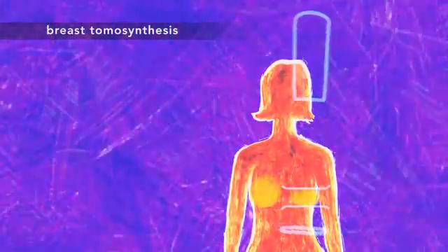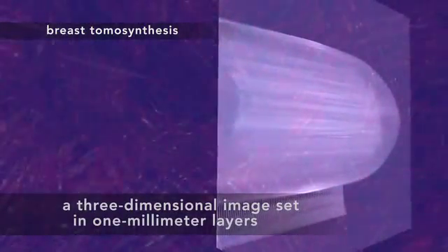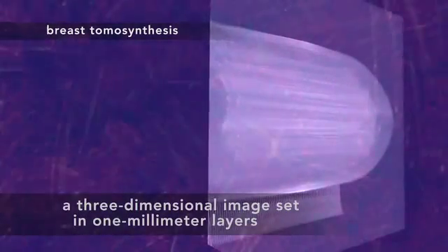That's because the x-ray arm swings over your breast, gathering enough extra information to create a three-dimensional image set. So now the doctors can see and search through your tissue in one-millimeter layers.